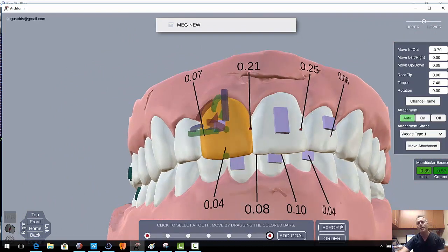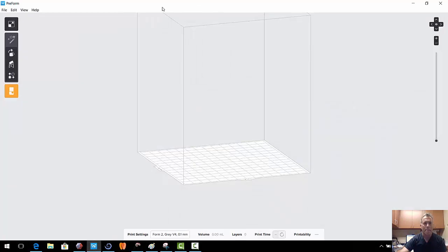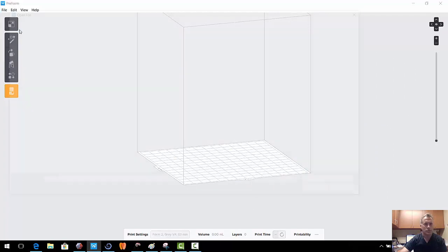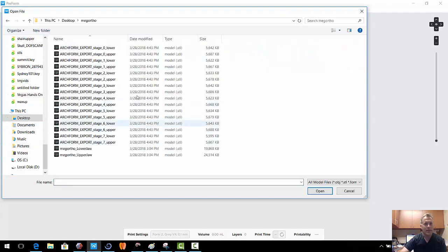Okay, so I'm not going to hit export. When you hit export, it generates the STL files and it charges you $50. So let me just go ahead and show you how we print these out. So I'm going to just pull up Preform and add. So we can go Meg Ortho, and I'm going to select all of them.